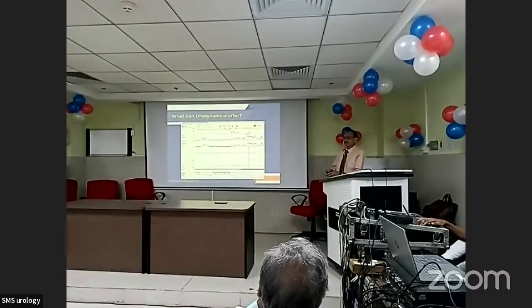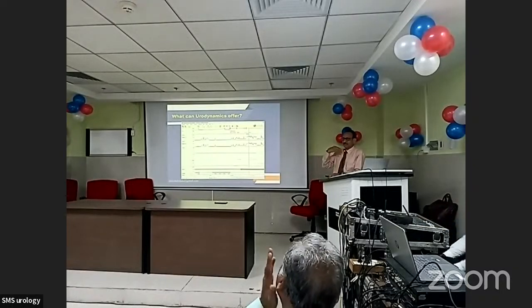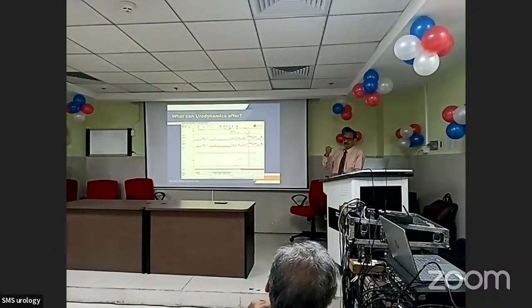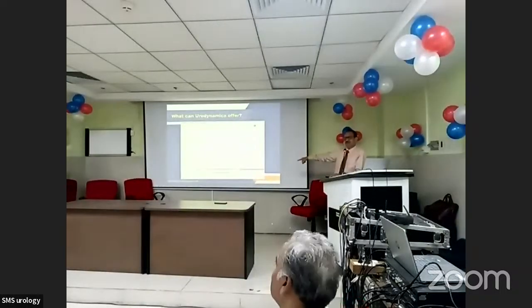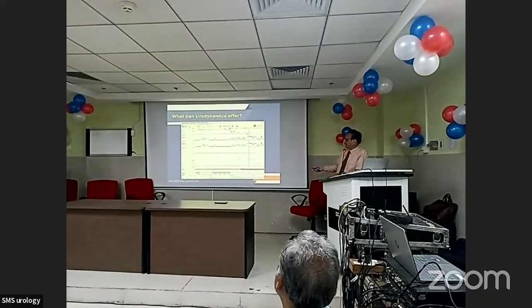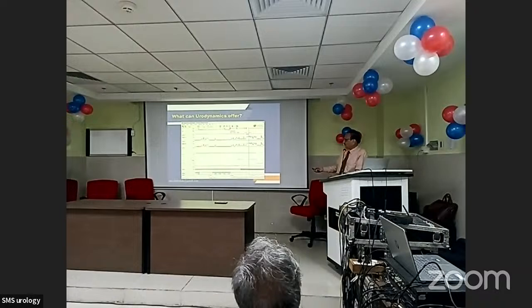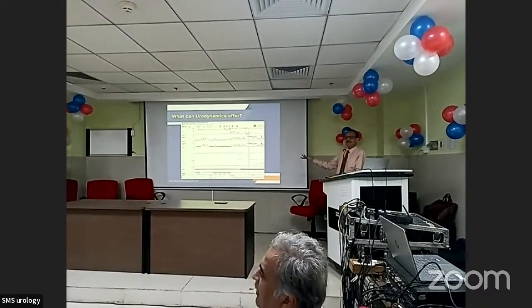She must relax her pelvic floor to void. I agree. But when she cannot void because of a poor detrusor, she uses external abdominal muscles to expel the urine. That is the phenomenon, and that's correctly recorded. With a short rectal pressure rise, subtracted well, no detrusor contraction, there is a flow because of straining, and because of straining there will be a rise. So it's all perfect; it demonstrates the phenomenon.